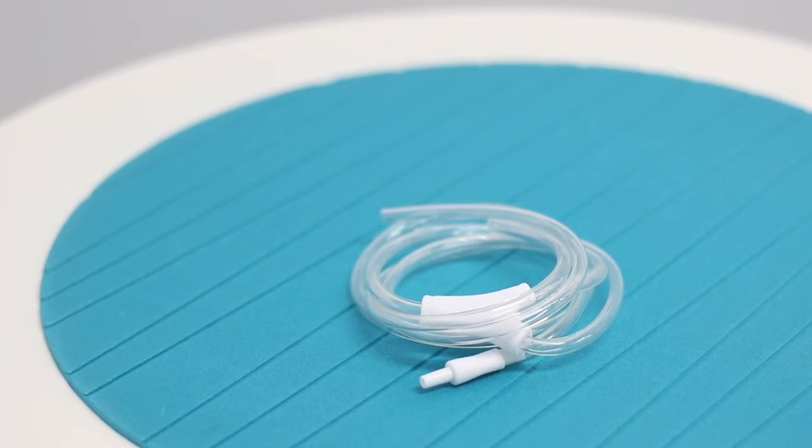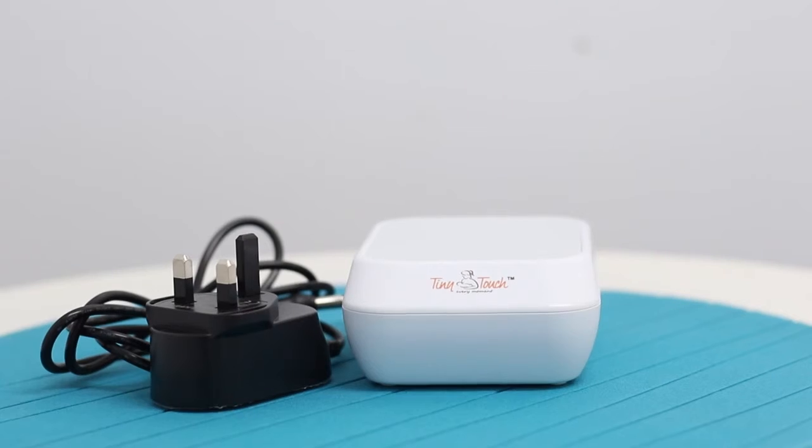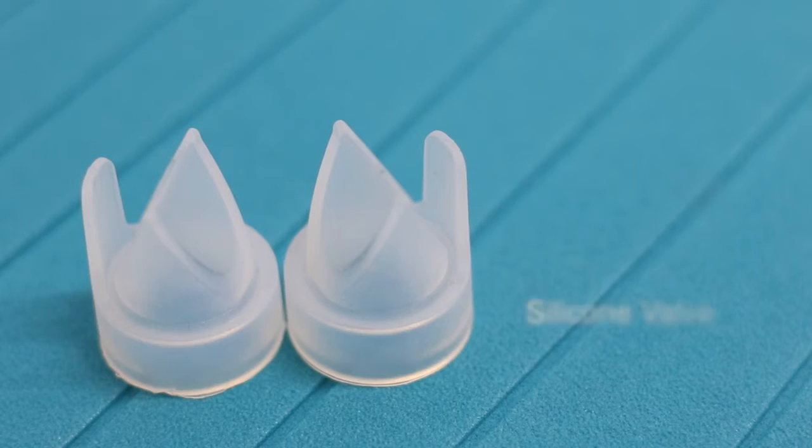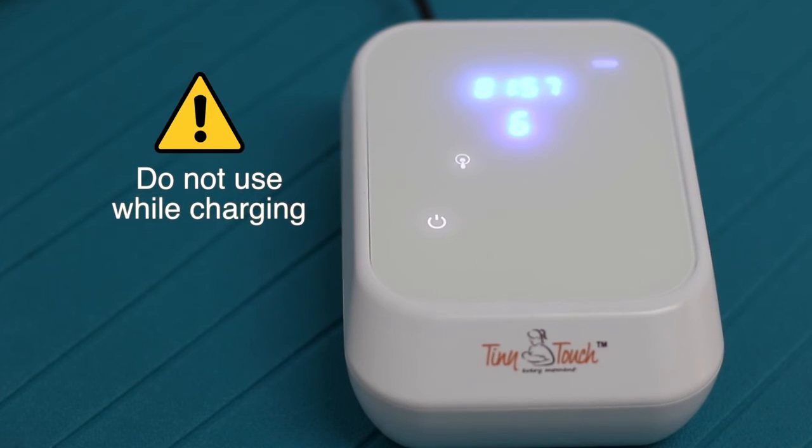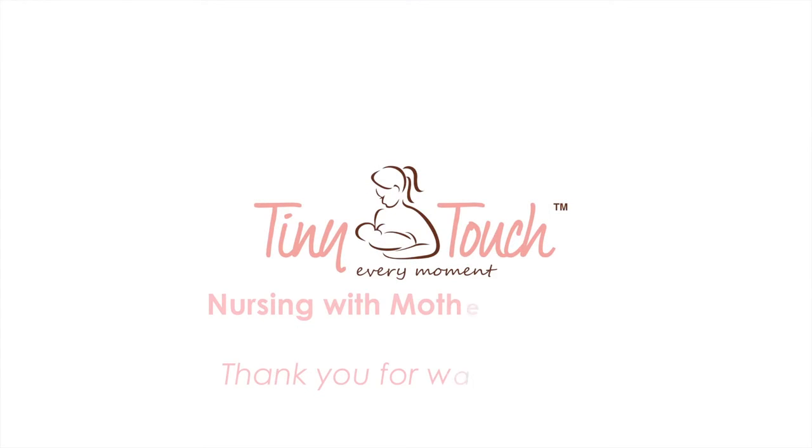Please note that the tubing and adapter should not be washed. Make sure the silicon valve has no visible gap. Use only the original supplied power adapter in the breast pump set. Do not use the main pump unit while charging.